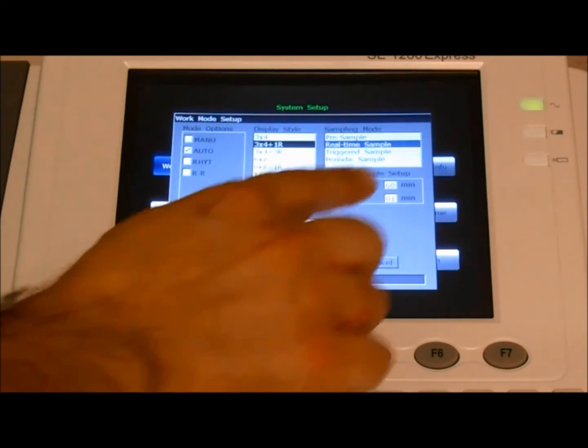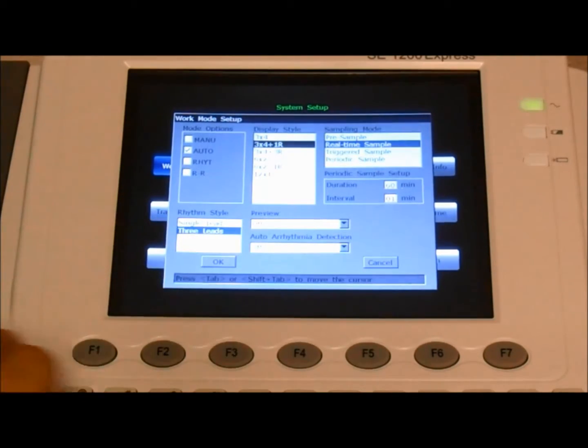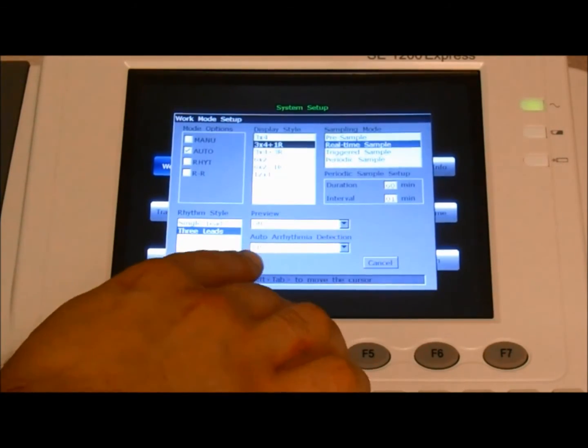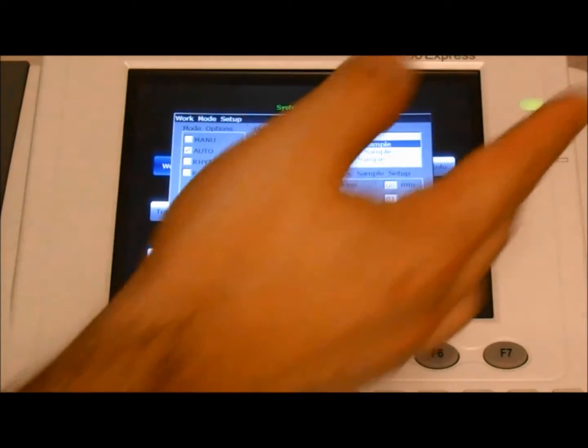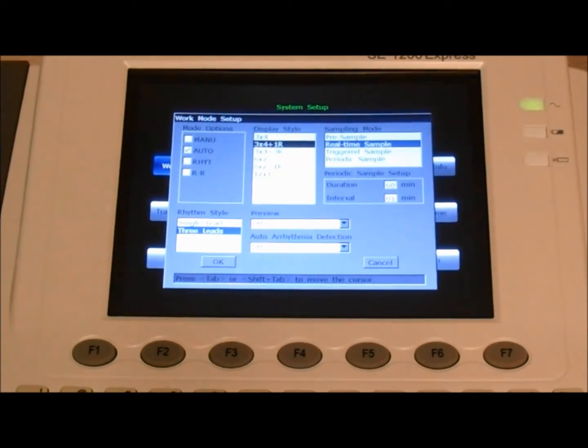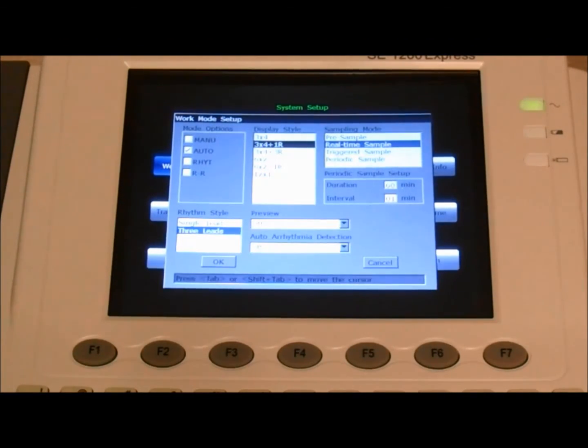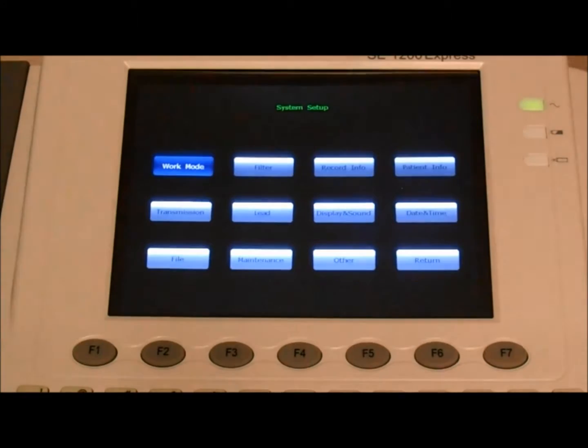Preview off, and auto arrhythmia, that's user dependent, but we'll keep it as off. Press enter to confirm.